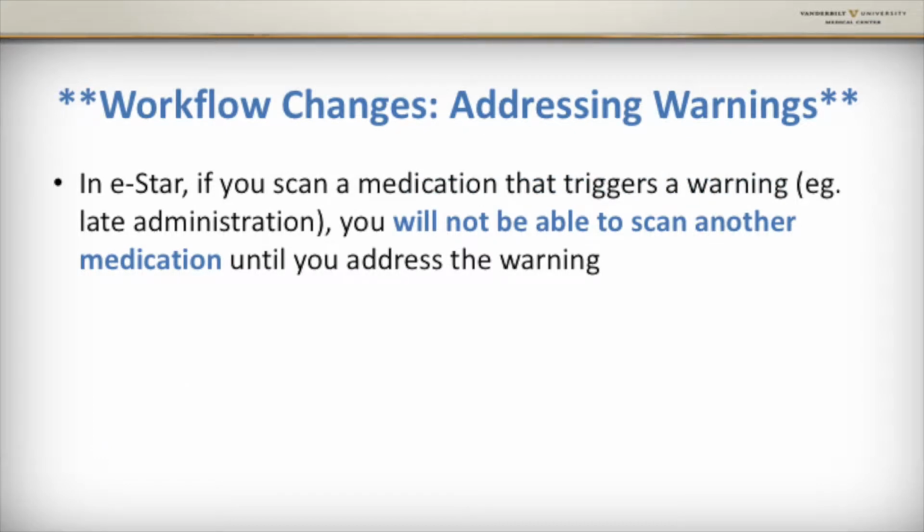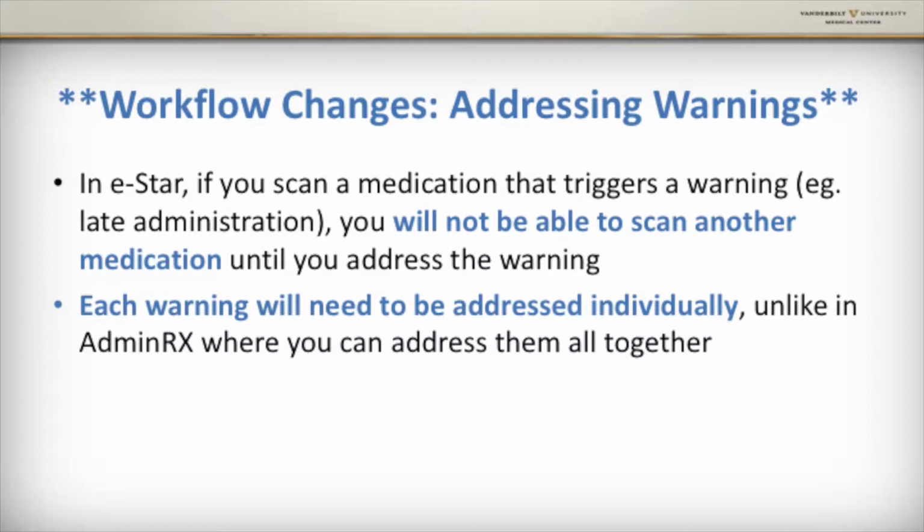In eStar, if you scan a medication that triggers a warning, like if you're giving it late, you will not be able to scan another medication until you address the warning. Each warning will need to be addressed individually, unlike in AdminRx, where you can address them all together.